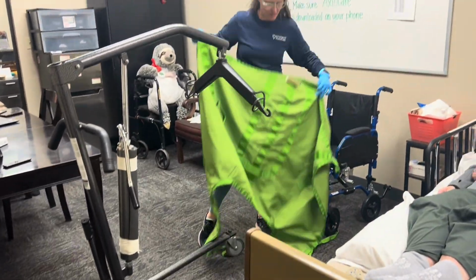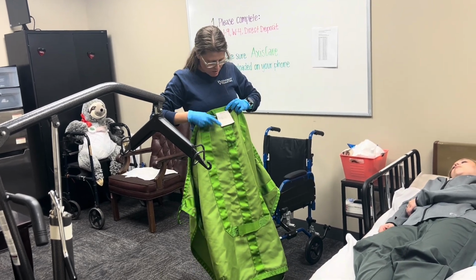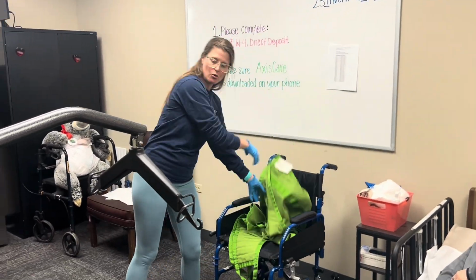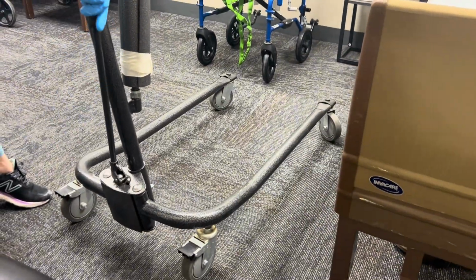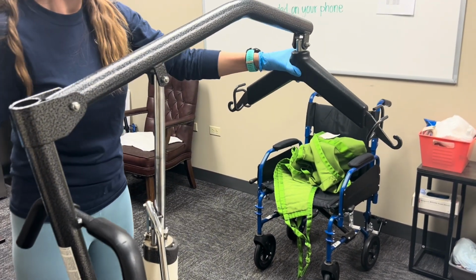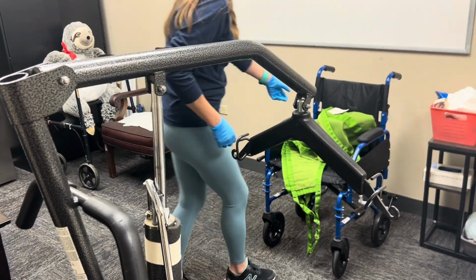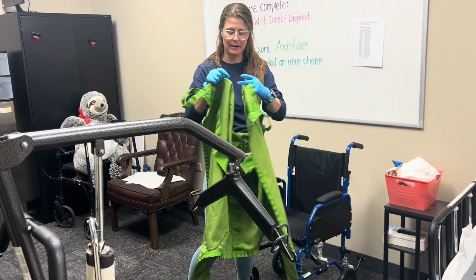The sling usually has a top side and a bottom side. You will be able to see a little tag that will mention how to use the sling. Please use that as your reference. Most Hoyers have the capability to move the legs out and in. There are also brakes. All Hoyers have brakes. That's locked. That is unlocked. Hoyers go up and down, up and down. Slings are similar, but often different. We will talk more about the sling when we're going to get Michaela out of bed.